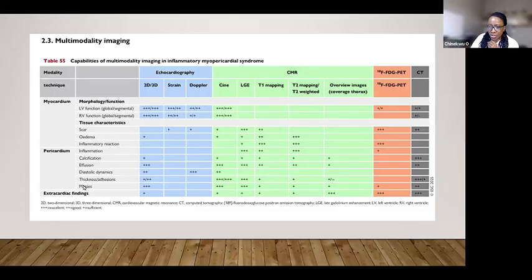But when you get into tissue characterization, that is where MRI is complete king. Echo can probably estimate that there's a scar using novel tissue assessment tools like strain and Doppler. Echo can probably tell you there's edema because you can literally see that the myocardium is thicker and that there are some tissue differences compared to where it's not edematous. But it's the eye of faith and eye of experience that can tell that. MRI can tell you that without a doubt, completely accurately and reproducibly.